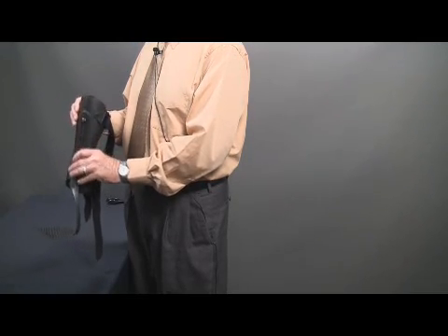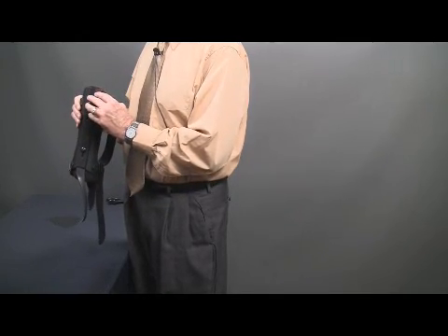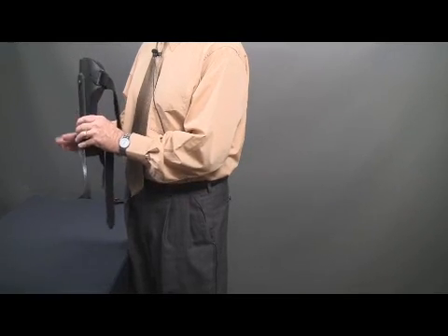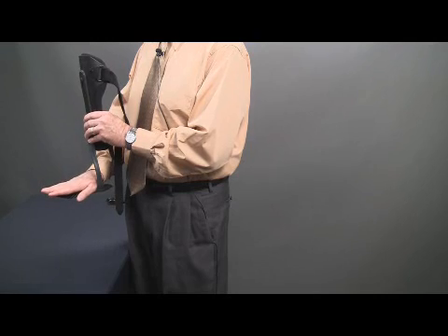If you actually needed a large, what you could do is you could raise the shell height without trimming it. You could just place the orthosis in the shoe and then put a good orthotic or good interface on top of it, pulling it back and just positioning it.